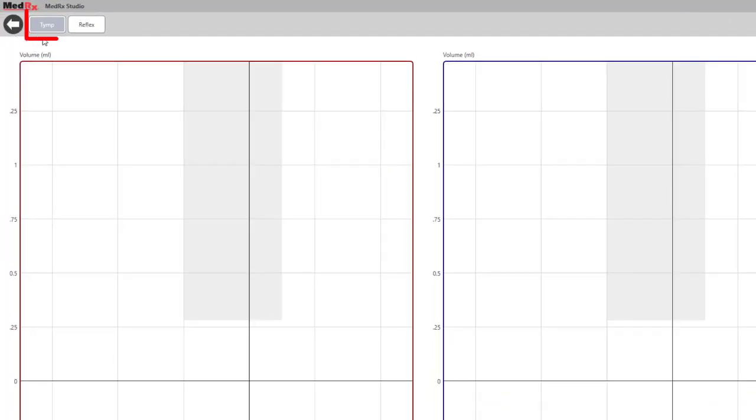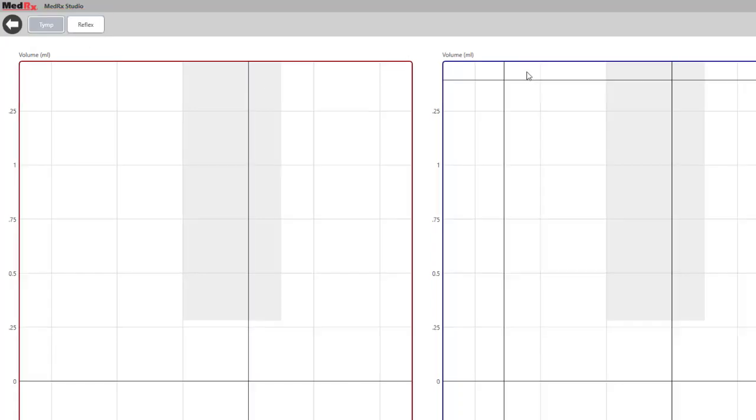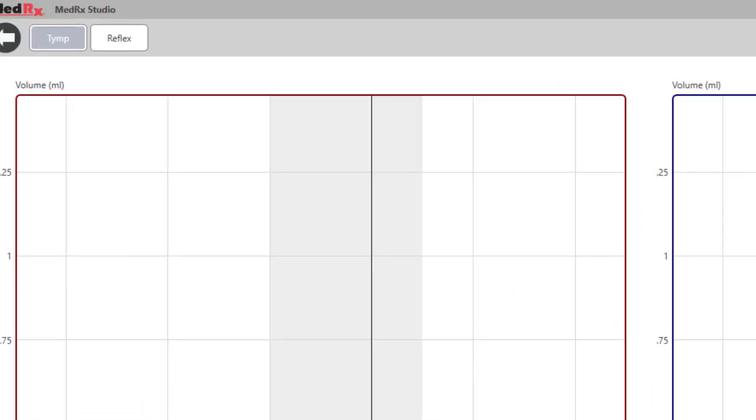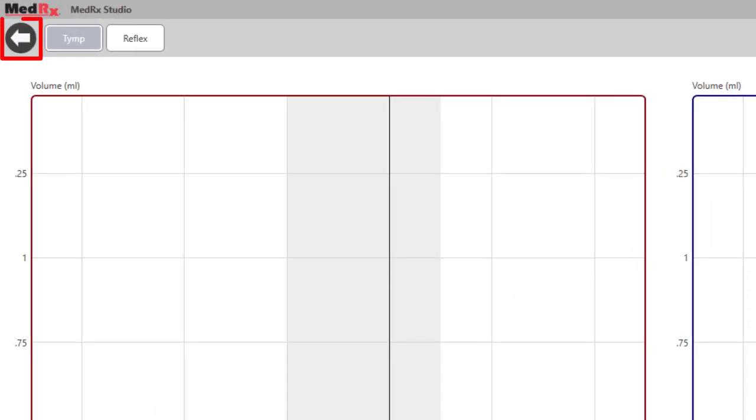There are two tabs that can be displayed, tymp and reflex. The next two disk icons allow you to save sessions. You can also save when finished by clicking the back arrow in the top left corner, exiting studio, and then you will get a prompt to save.